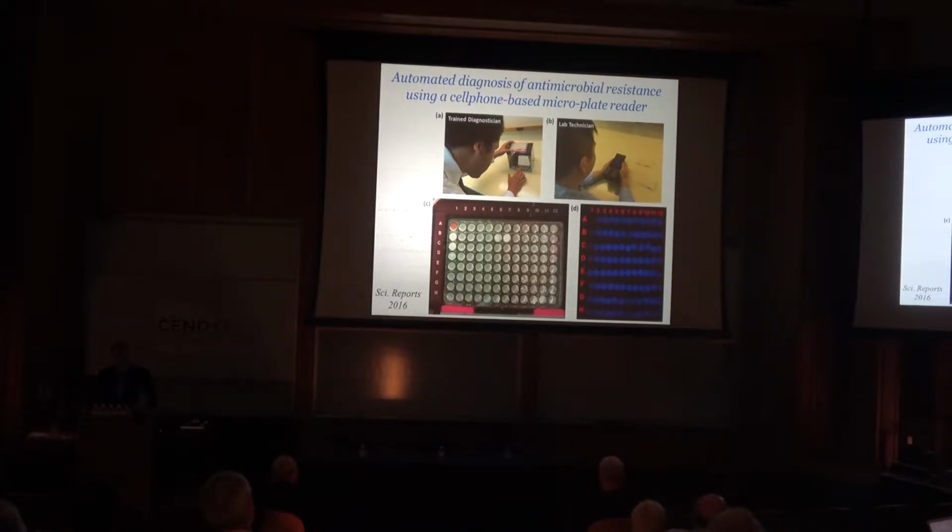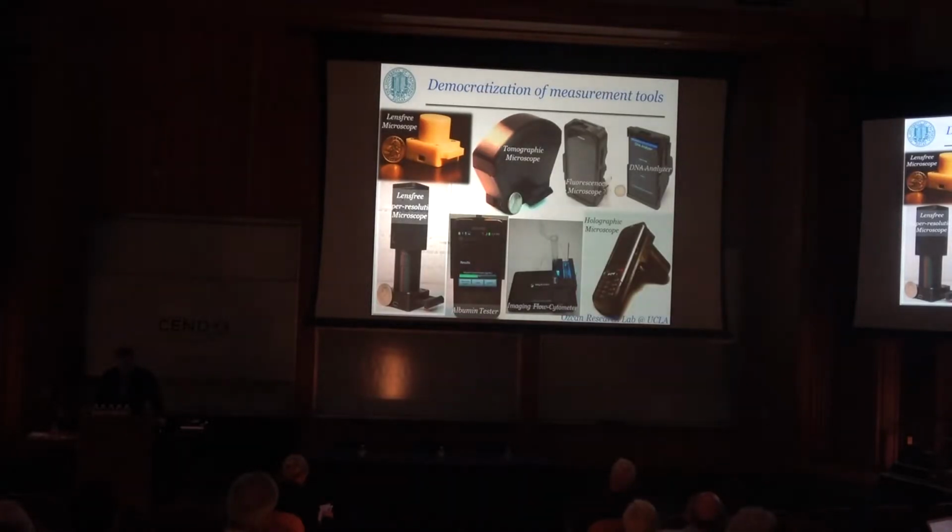This is today done manually because, believe it or not, that's the gold standard. That's beating out anything else. This is not recognition of the organism. This is essentially an organism isolate that is being tested for MIC measurements. We've shown also a very good match to an expert diagnostician for these MIC measurements performed on patient isolates, showing that it's actually coming a long way in terms of its performance in addition to its mobility and cost effectiveness.